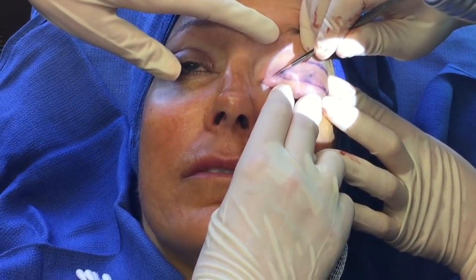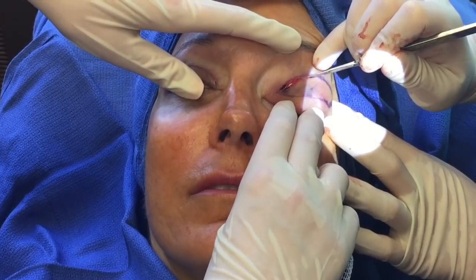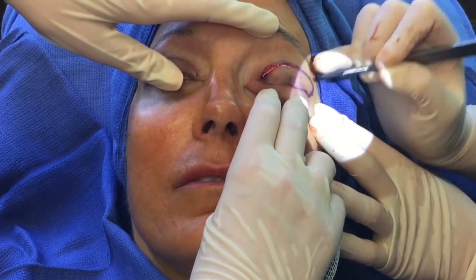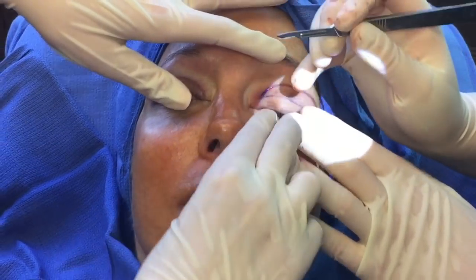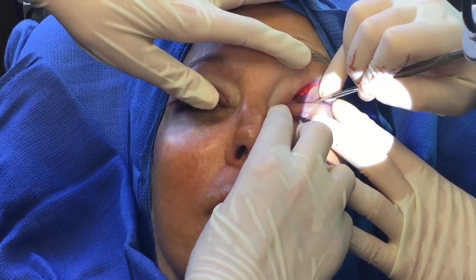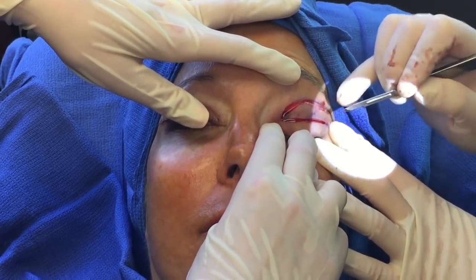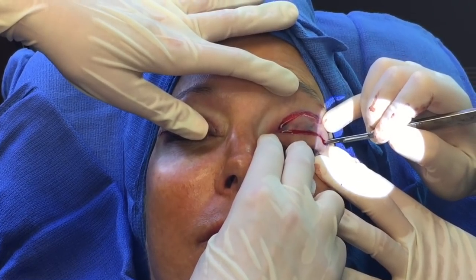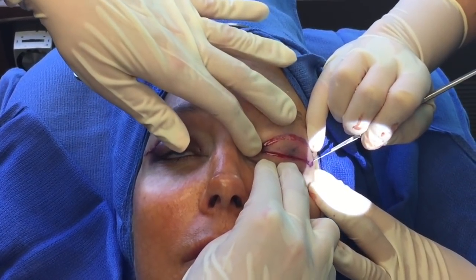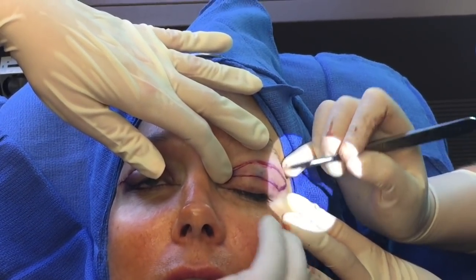I'm making the incision now, going through the skin. The patient doesn't feel anything — once the injection is done, this procedure is completely painless and very well tolerated. She's awake, doing well, and comfortable. Often patients will be talking during the procedure. The recovery is around a week with minimal downtime. The swelling you see more of right from the injection than at completion.